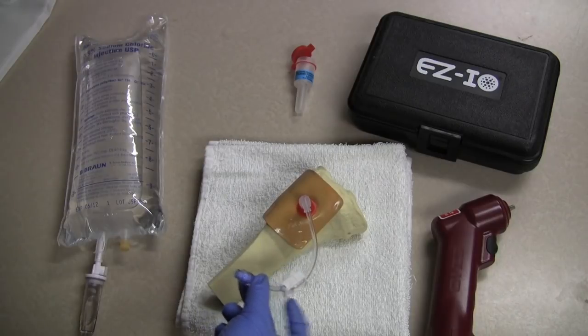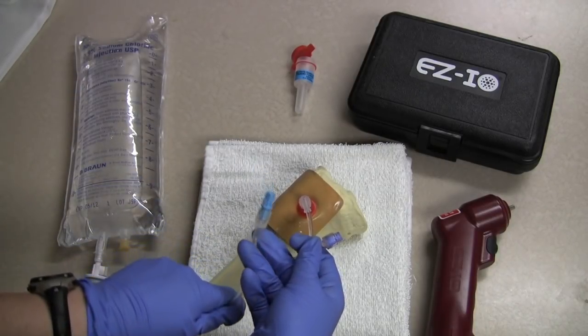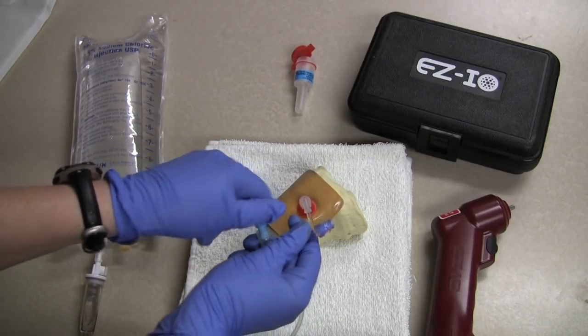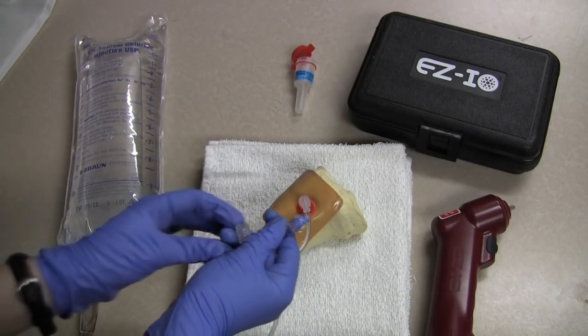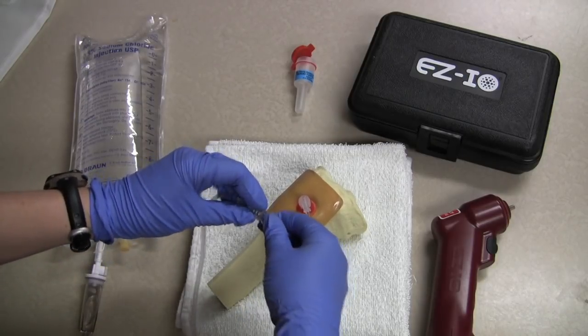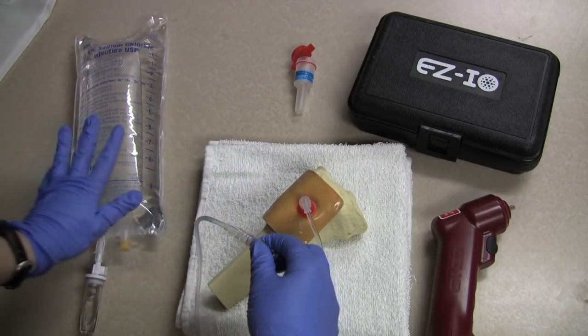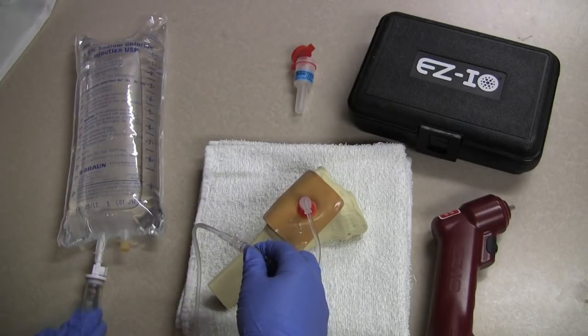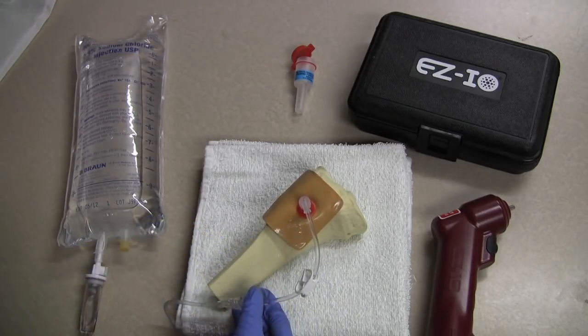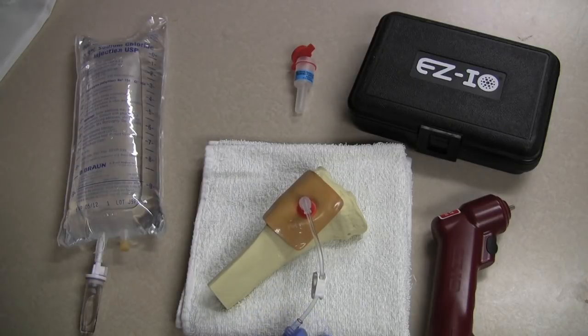We are going to connect the drip set. Remember the bag needs to be hung significantly higher than the IO site. I am going to open it up all the way.